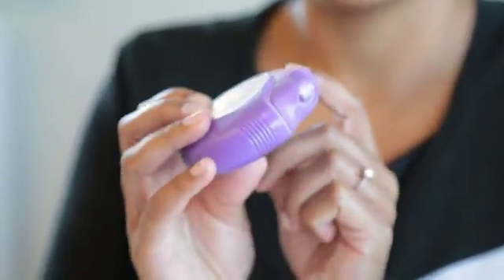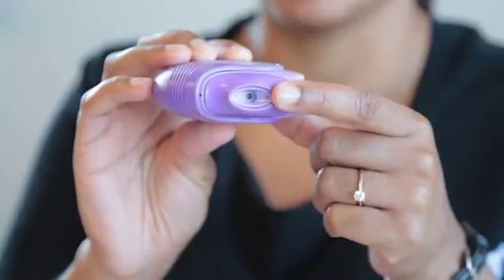Use your finger to push the lever away from you. You will hear a click. From here the shutter is open and the medication is ready for you to inhale.